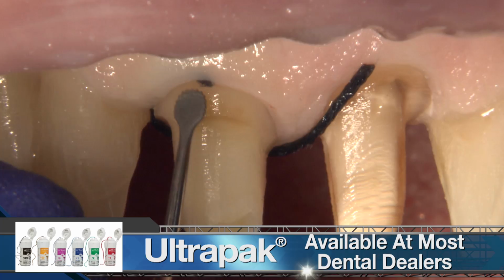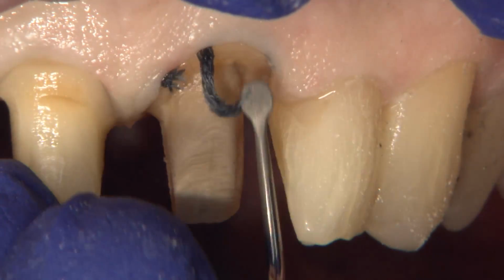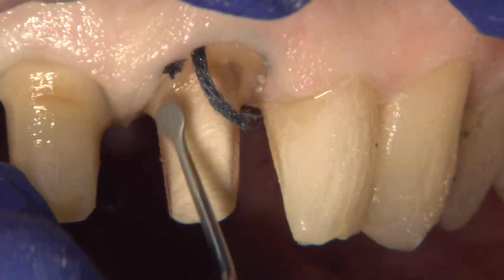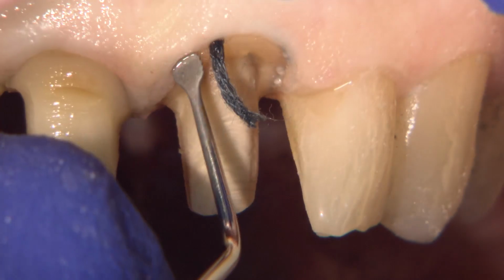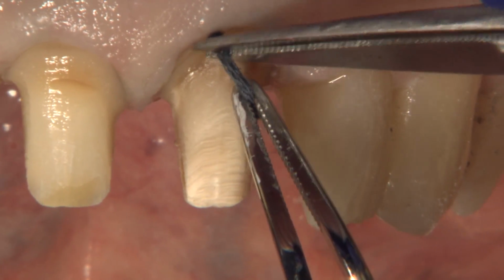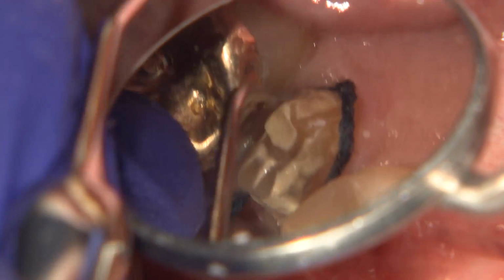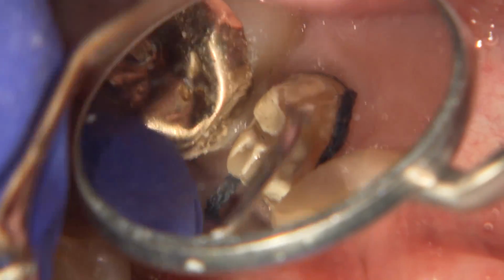I first start with a smaller size 000 and place that down into the sulcus, and that will help displace the tissues more apically, and also it helps some with moisture control as well. So I go ahead and place the 000 around number 8, number 9, all of the preparations, just so that I can also see more of the preparations as well.